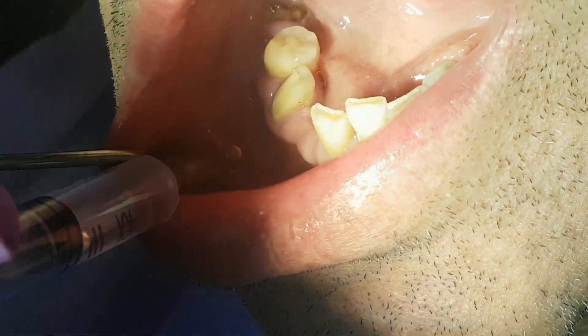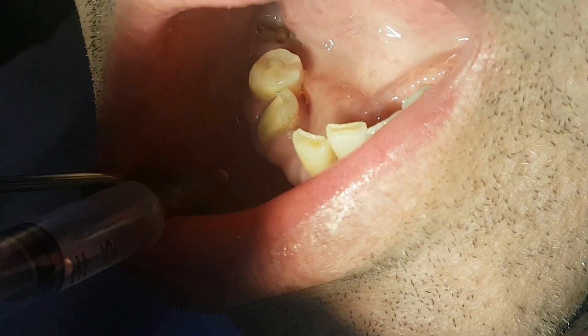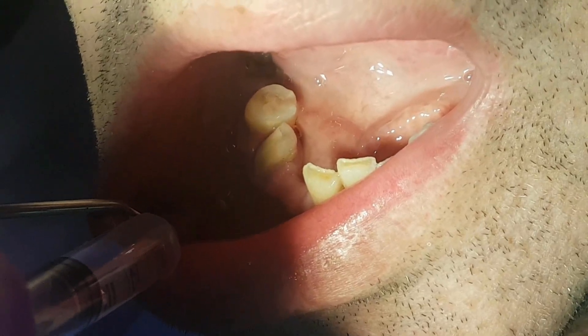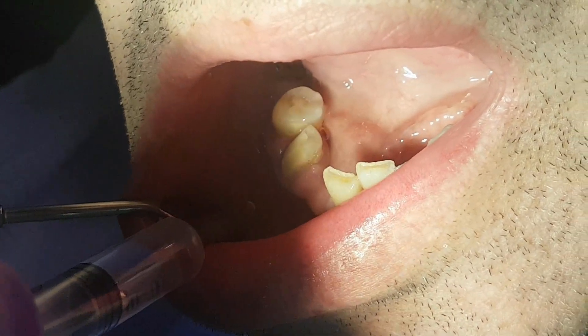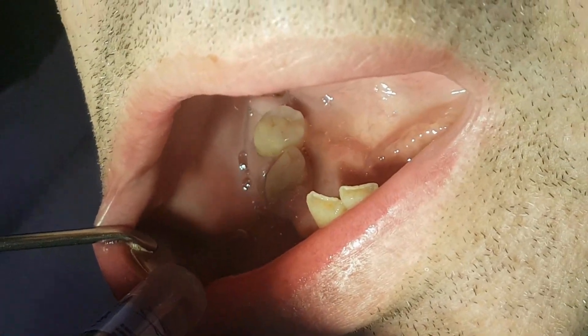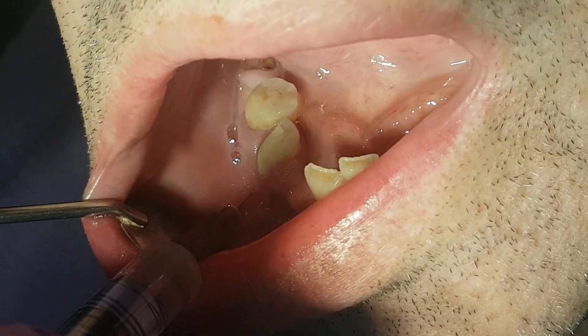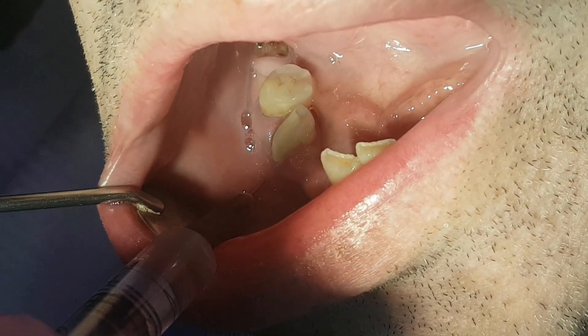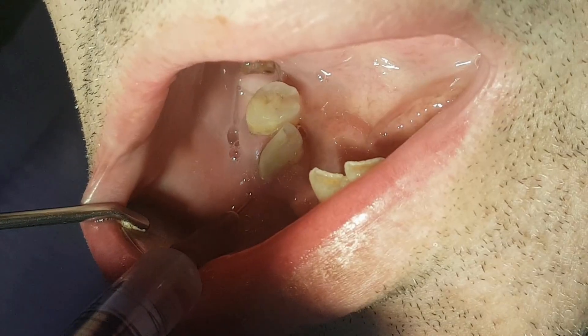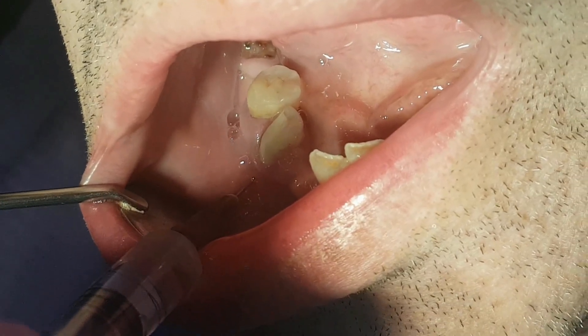First we start with applying local anesthesia, also called plexus anesthesia. We have a special video where we deeply describe this technique. We apply the anesthesia slowly so it's less painful for the patient.